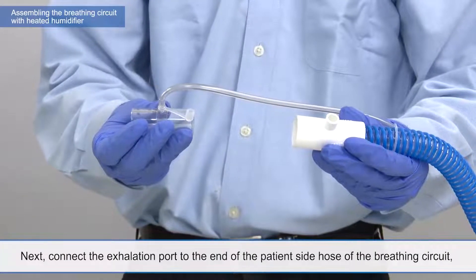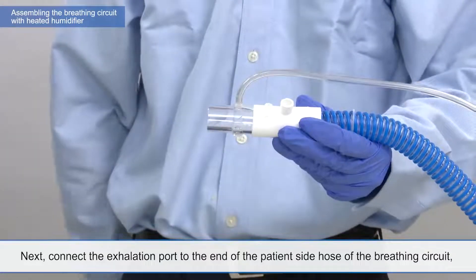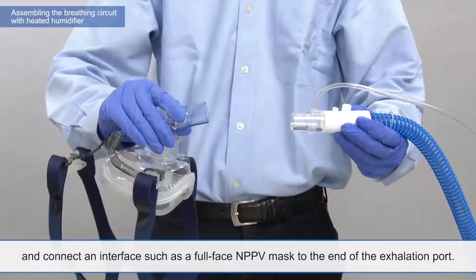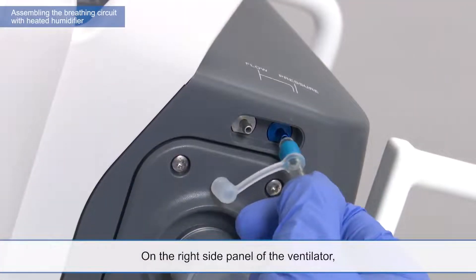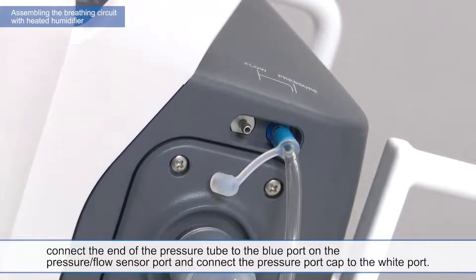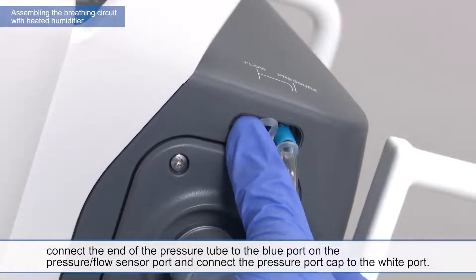Next, connect the exhalation port to the end of the patient side hose of the breathing circuit. And connect an interface such as a full-face NPPV mask to the end of the exhalation port. On the right side panel of the ventilator, connect the end of the pressure tube to the blue port on the pressure flow sensor port. And connect the pressure port cap to the white port.